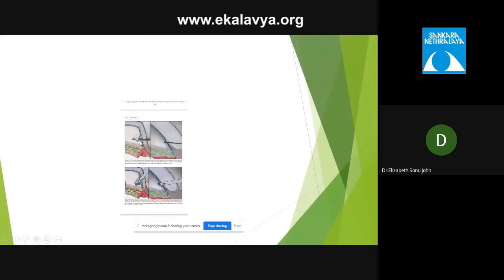And as you keep going in with the probe, the DM starts getting lifted up. So you're worsening the small DM tear that was there. This is again with the probe. As you go in, there's a small detachment. Again with the fluidics and the probe, the detachment is larger.